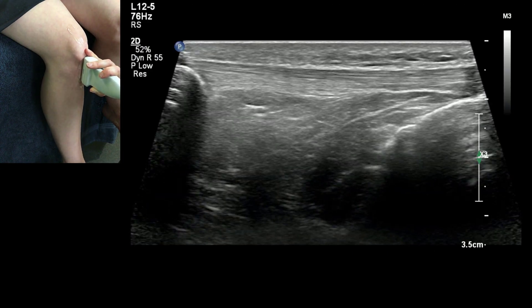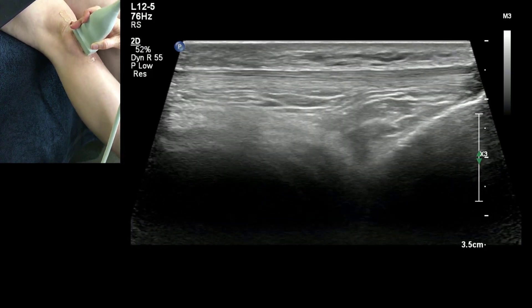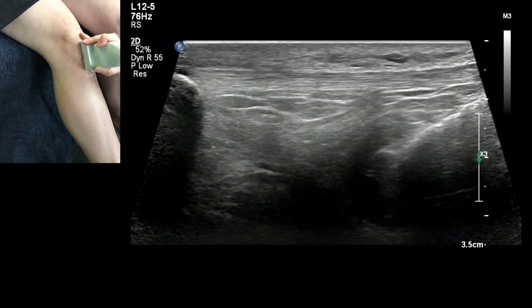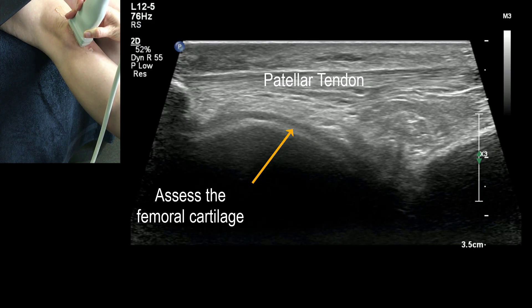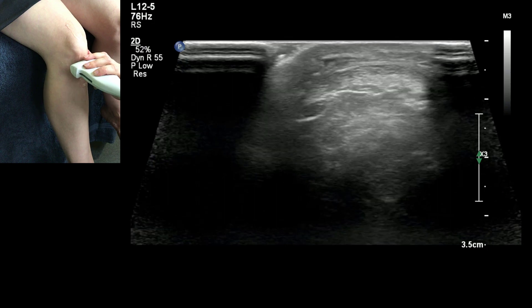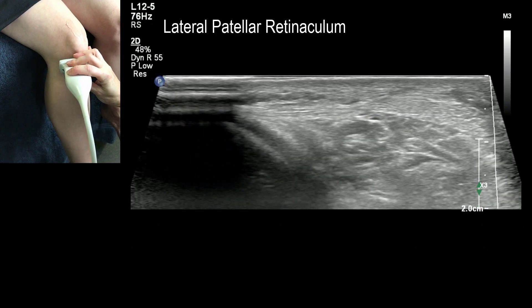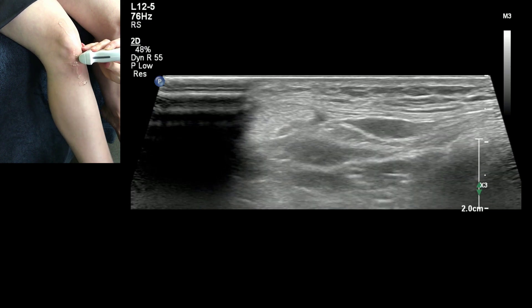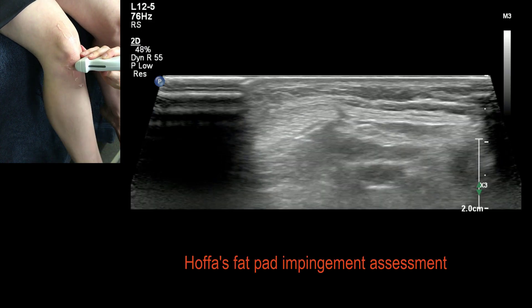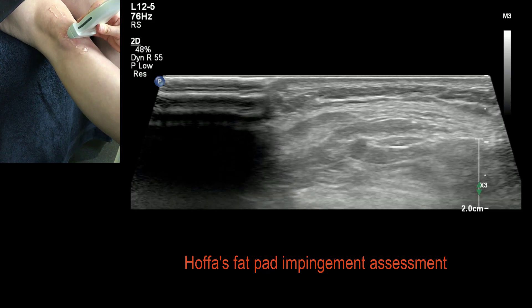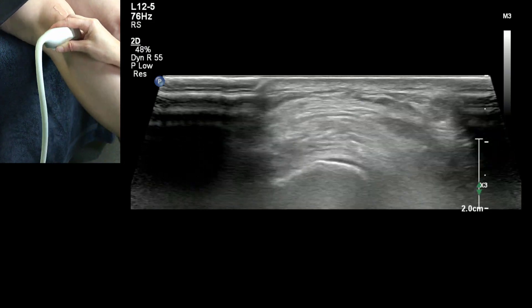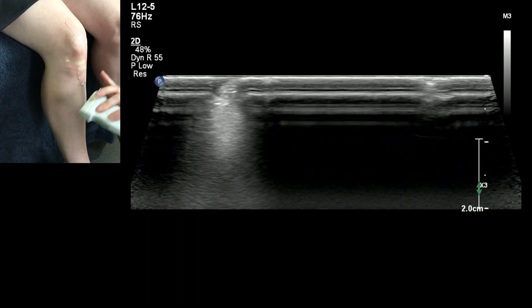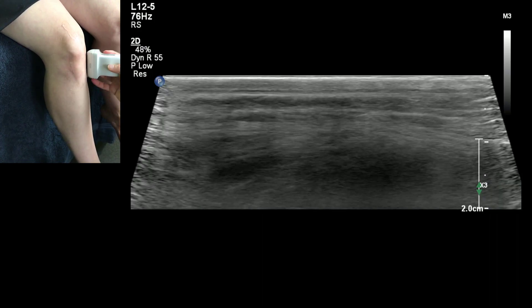Using a 12-5 probe, we extend and flex the knee — doing this for two reasons: looking for an effusion and any accessory ossicles. You can see the femoral condyle in the extended position. We also assess the retinaculum on both sides of the patella — laterally and medially. We watch the fat pad dynamically; on extension there should just be a slight little bulge with no clicks or pops. Fat pad displacing and clicking indicates fat pad impingement. The fat behind the patellar tendon sliding out slightly is normal.